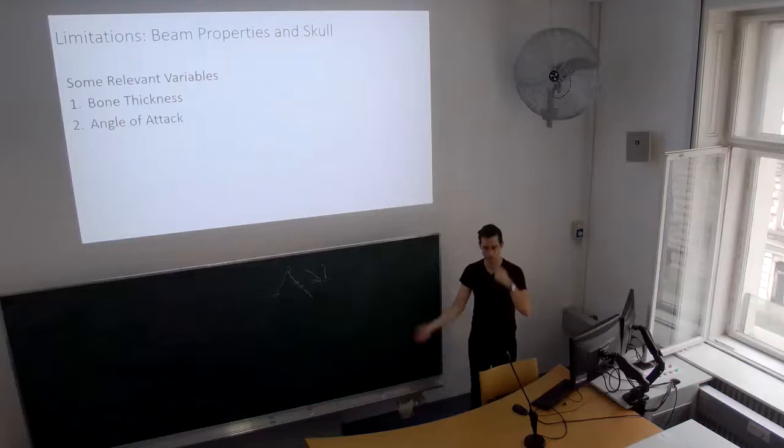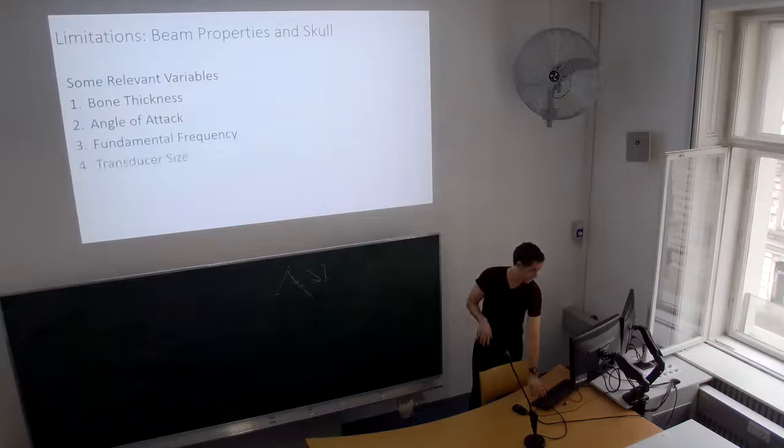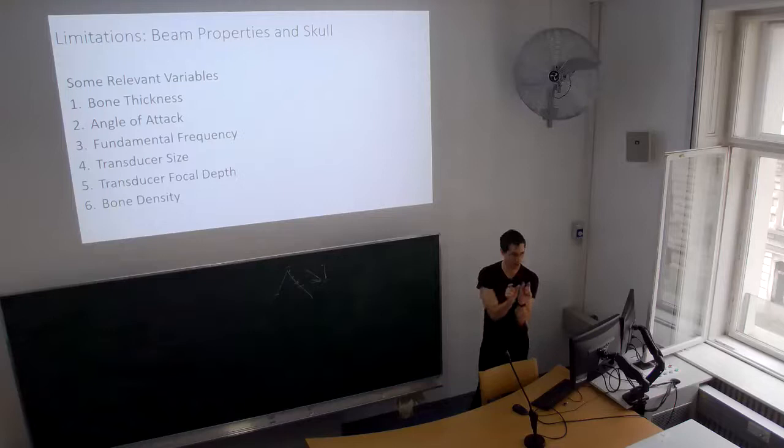The angle at which you approach matters too. Sometimes you need to hit a structure that's a bit under the ear. If I want to hit the amygdala, you kind of have to go at a bit of an angle, maybe a 5-degree angle, but any more than that and you start risking the energy just bouncing off. Okay, so that's important. The frequency you use, the transducer size, its focal depth, all of these things, and bone density, which is a really hard thing to measure, unfortunately. I didn't know this, but people vary a crazy amount in their skull thickness, and the density matters more. You can't measure that with MRI but you can measure it with CT. So this is something that we can't deal with in basic science, but it is something that matters.